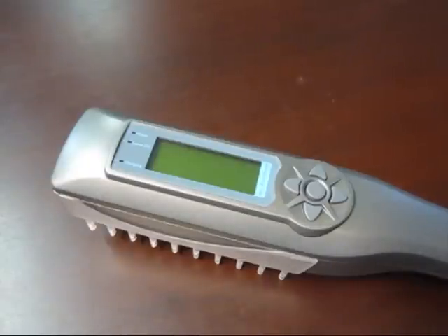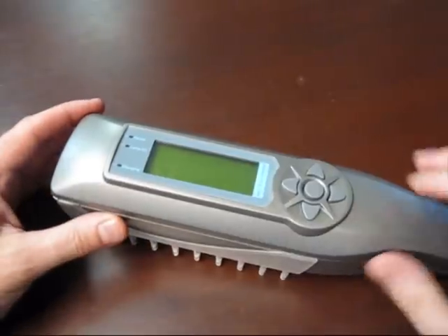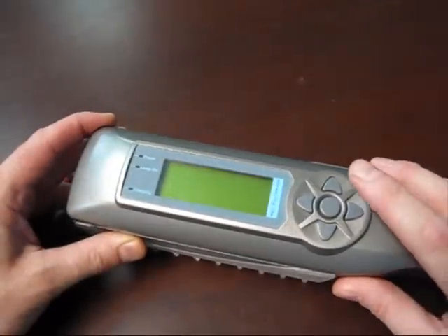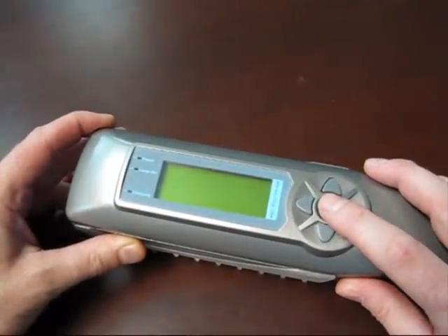In previous videos, it's been shown how to charge the batteries from mains power and how to start and complete the patient setup wizard. It's now ready to be activated. To turn on the Dermaray UV, simply hold down the enter key or the middle button for 3 seconds.